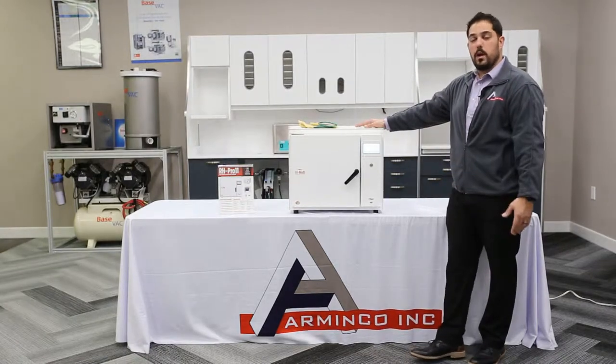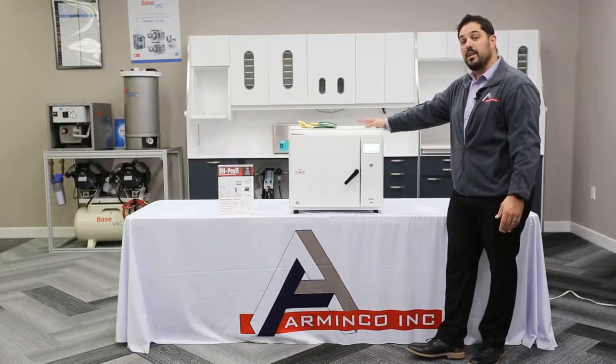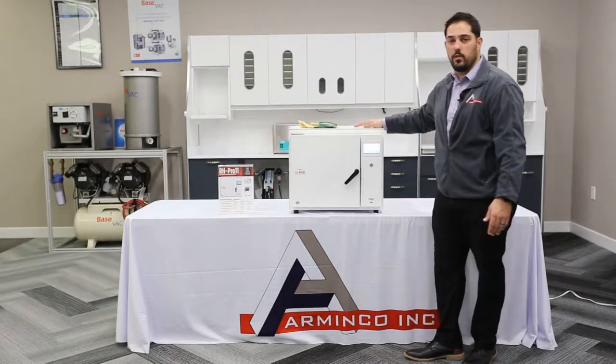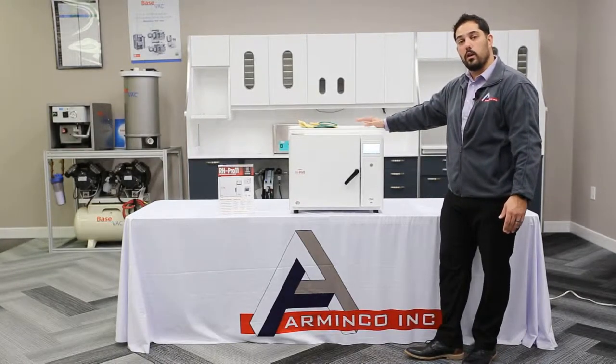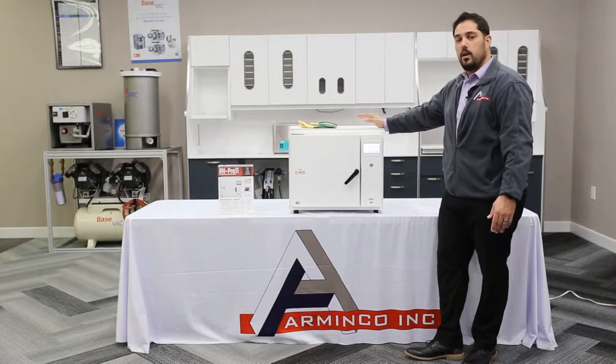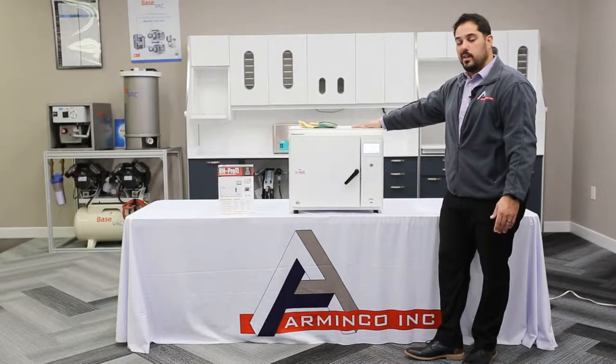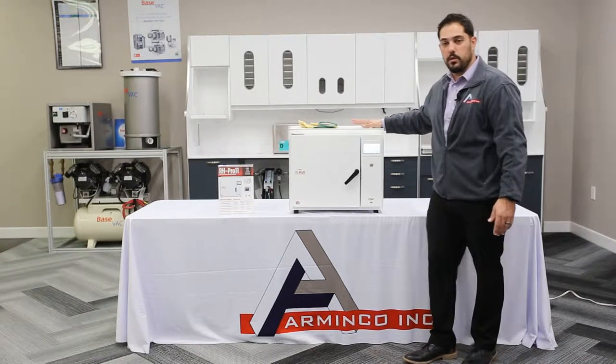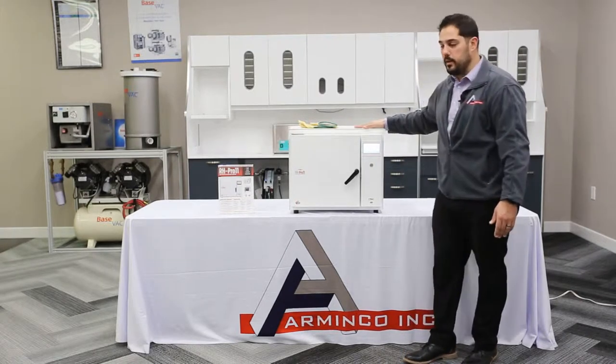One of the key features about this sterilization unit is that it is absolutely 100% waterless. What this means for you and your office is you don't have to worry about maintaining distilled water just for your autoclave. You also don't have to worry about steam, pressure, or any sort of corrosion or rust building up on any of your instruments and hand pieces.